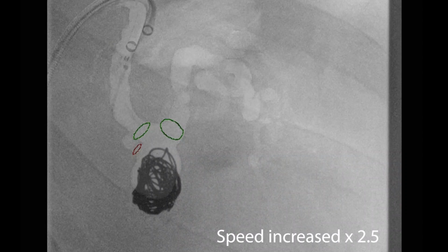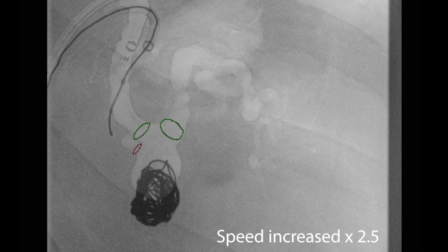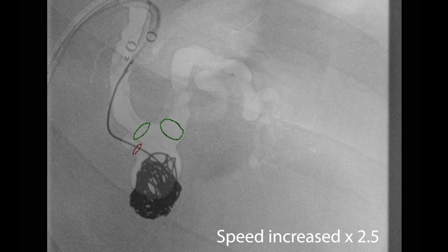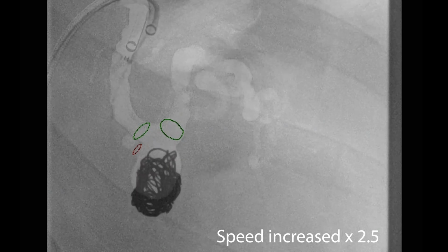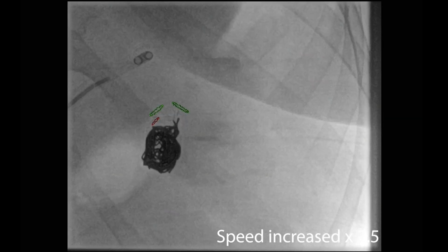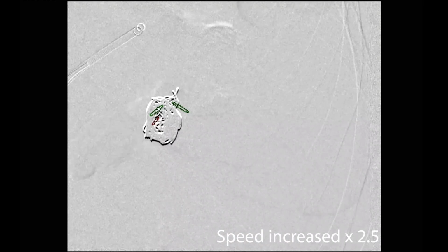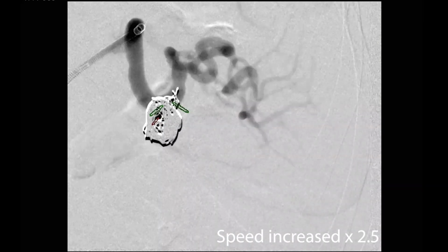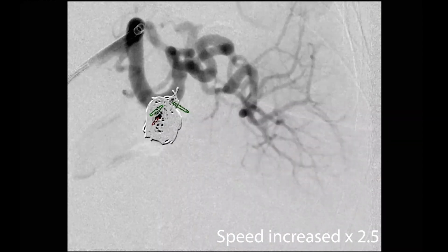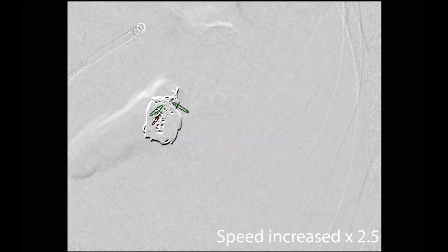And then we'll get a completion angiogram once we put in the last of the coils. There isn't much room to put many more coils in there. That's pretty dense. And you can see on the angiogram, all the branches are actually flowing. We opted to stop at that. The patient got follow-up, and actually the branches were still flowing on the 1 month CT scan. Thank you.